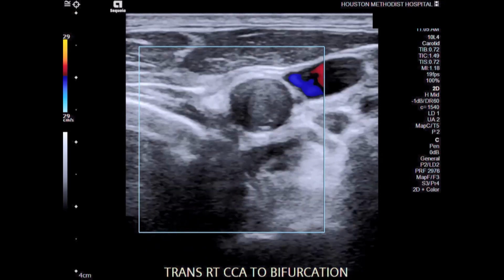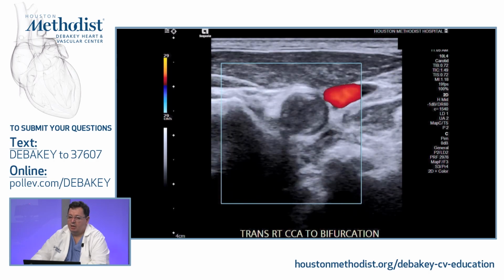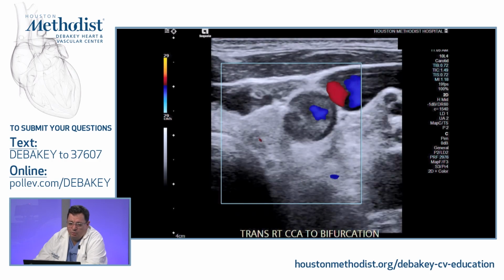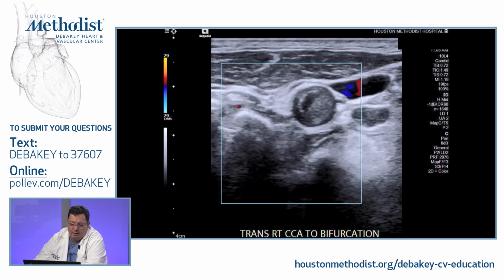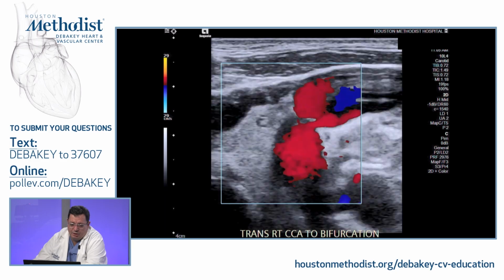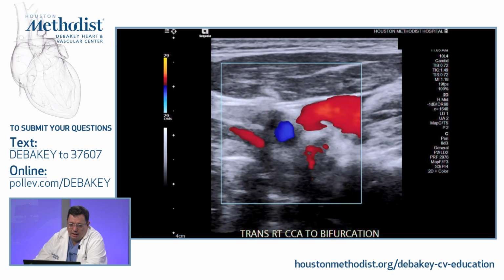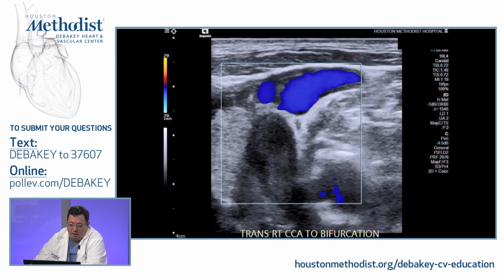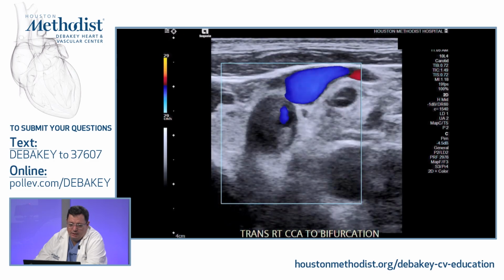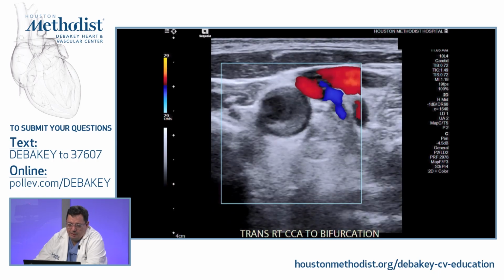And interestingly, the little bit of color gives you a flow in the proximal, but where did the color go? Or maybe the flow is enough to supply the vasa vasorum on the wall with these occluded vessels, so make sure the walls still remain intact and something needs to supply the wall. So this is where the vasa vasorum flow comes in, but we're just not sensitive enough to pick up with the 29 filter. So when we go after these occlusions, I think we need to decrease my color box and also drop my color scale. We dropped it to 20. You can see 29 goes down to 20. That's kind of cool. Someone was just reading my mind throughout the clip.